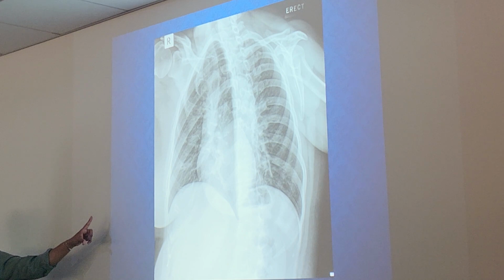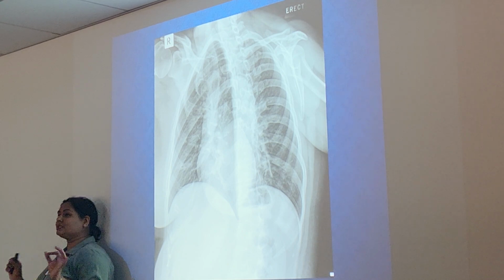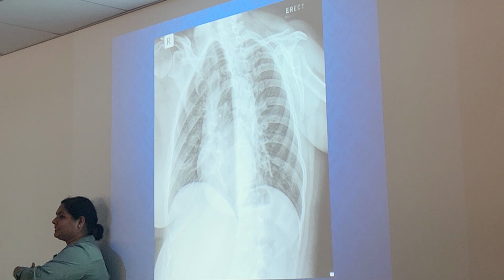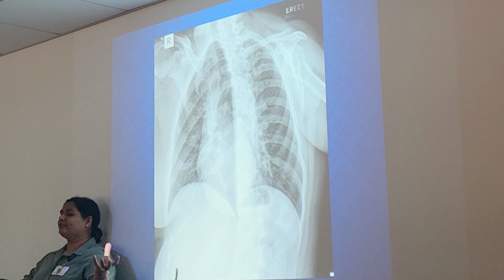RPO? So if my right side's touching, and then a posterior oblique. Oh, yeah. I feel like I probably lost somebody on that. So this is an LPO, not an RPO.